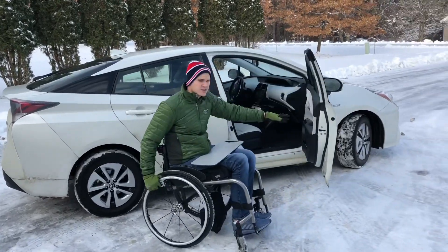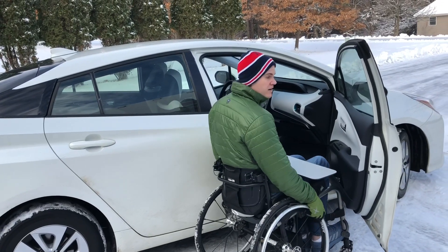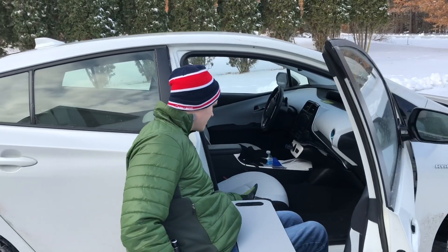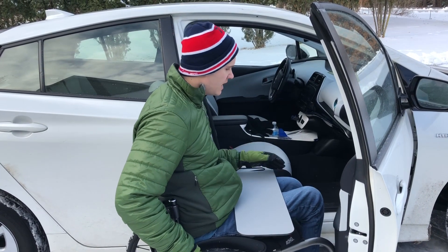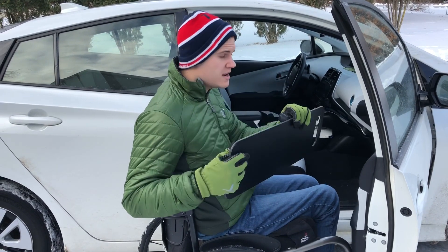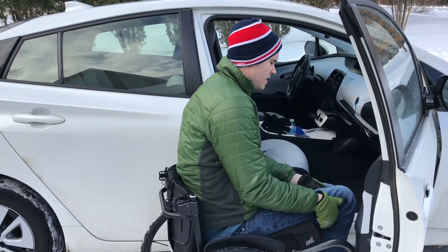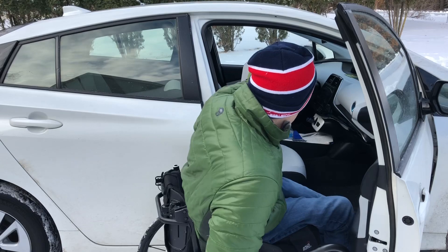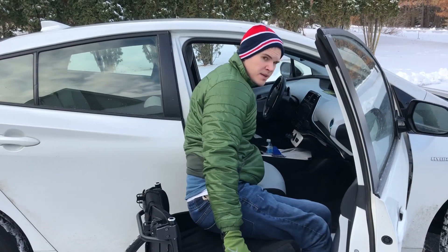So when I first learned how to transfer, the transfer board was crucial for transferring into vehicles because, as you can see right here, there is a big gap. See how big this gap is? I need to be able to get my body into this seat, and at the beginning I didn't have the skill to make that transfer. I start by getting my legs down here, then I tuck this underneath my bottom, and now it's a bridge.